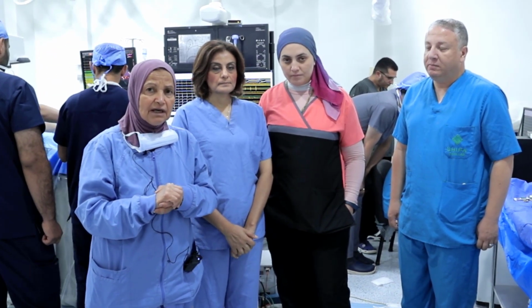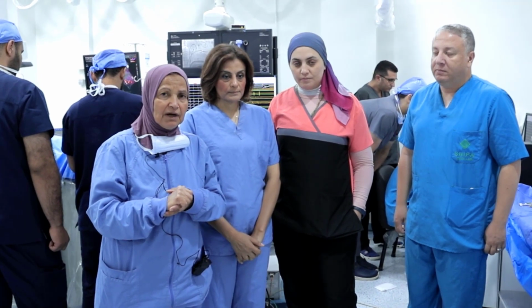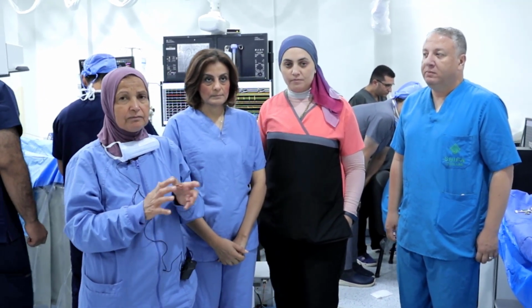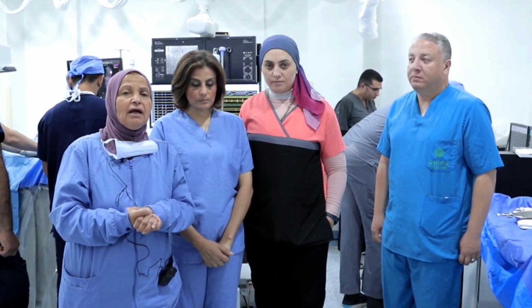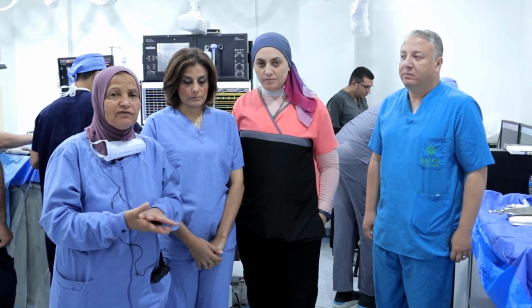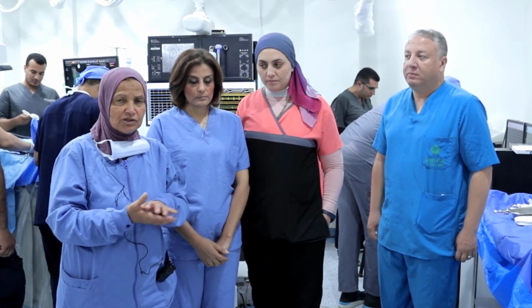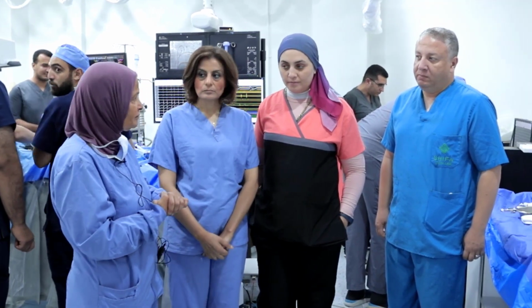This atrial tachycardia was non-sustained. The first attack was terminated by IV amiodarone. On the other Holters, on beta blocker only, he had non-sustained atrial tachycardia. Today we brought him; his ejection fraction is normal, and he underwent TEE, which was clear and normal. His left atrium is 4.3.